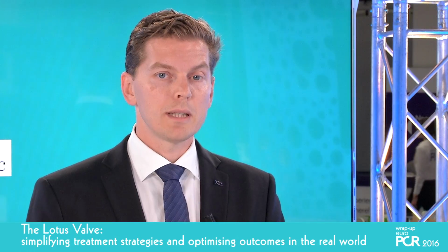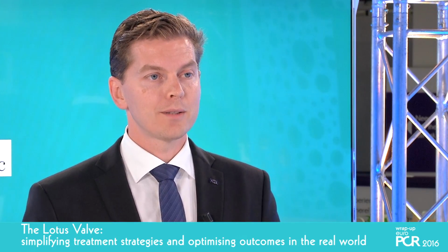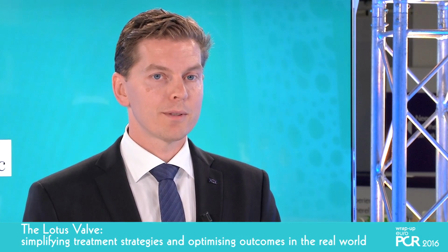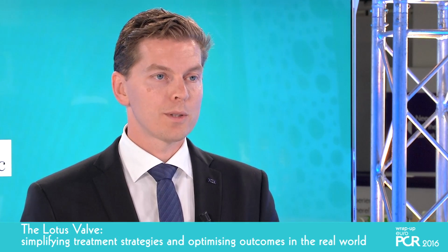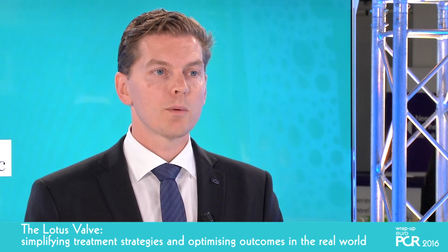So you mentioned 3 things: smaller sheath size, flexible system, better visualization of the locking system. Yes. What about the DepthGuard? Can you explain, is that going to be integrated? Yes, so DepthGuard is really a change in how the valve is being extruded, flared from the delivery system. What it does is reduce the amount of ventricular foreshortening, which is observed with the current generation Lotus. So we hope it will be a more predictable way to implant the Lotus valve. I think all these features together will help to simplify the procedure further with the next generation Lotus.